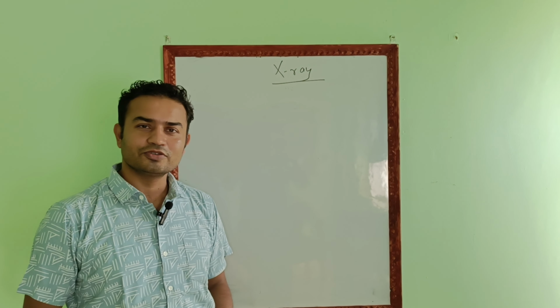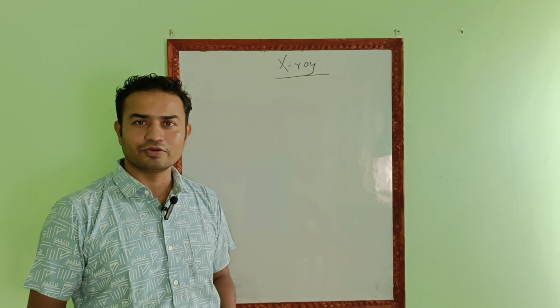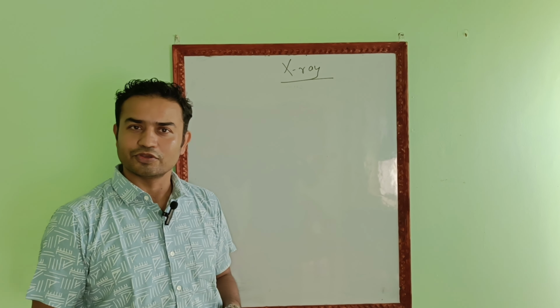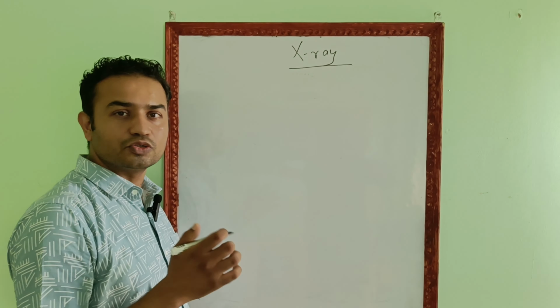Hello friends, today we are going to discuss how to read X-ray in case of orthopedics. There are various points you need to focus on. For your easiness, I have divided those various points into various steps, so it will be easy for you to remember. So let's start this. I have divided those into steps 1 to 4.